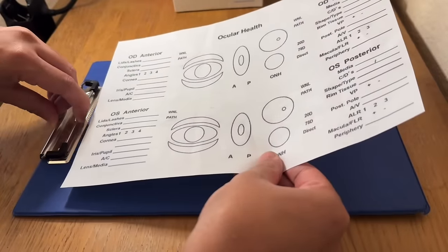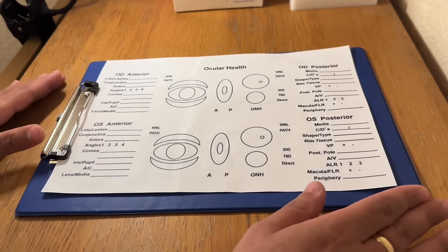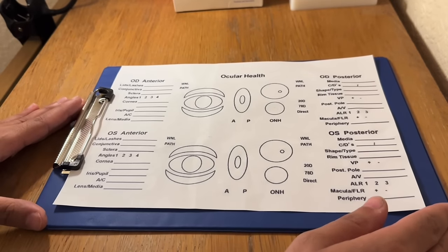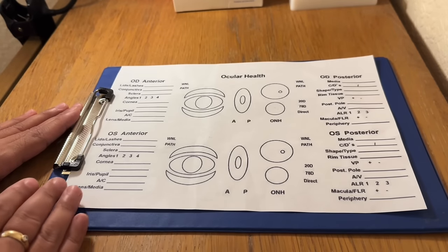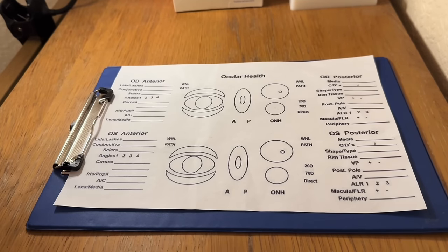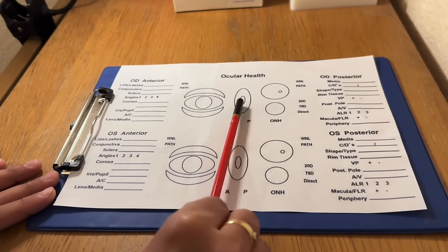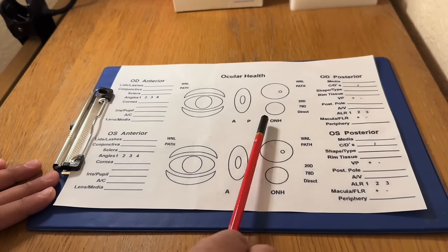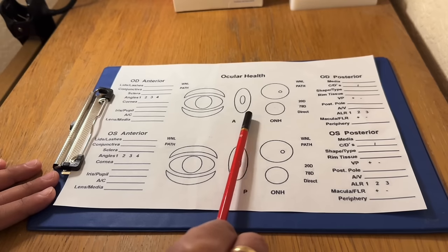And so we complete the fundoscopy of the left eye. Thank you. It is very important that you record your findings on your record card. I just want to show you this handwritten ocular health record card template. These record cards are particularly useful because you can illustrate your findings in the sections there and make some notes and annotations about what you've found.